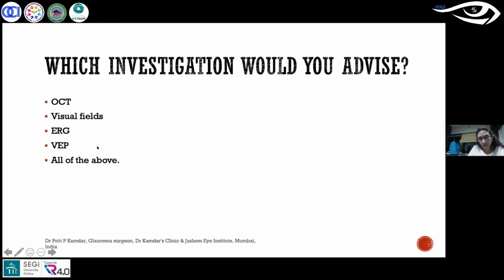Now, I did not do any of the above. I just did a visual field. And first, we have to know that when you advise a particular test, what are you looking for? So when you advise an ERG, what are you looking for? For that, you have to know what that test is going to tell you. VEP, what is that test going to tell you? You have to have that knowledge.